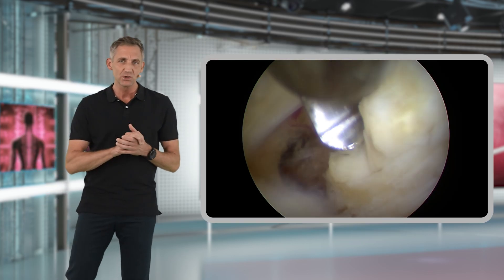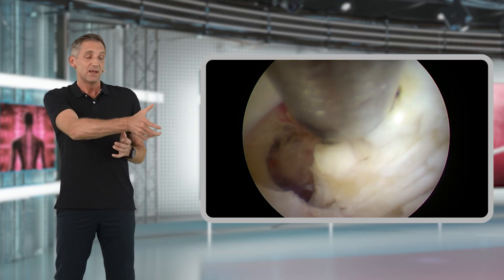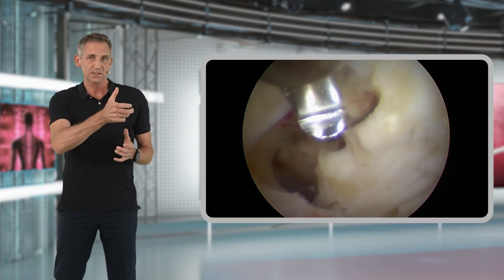Same as in microsurgery: when you take your bites to remove yellow ligament or bone with your Kerissons, you should lift the Kerisson slightly away from the dura before you take your bite.